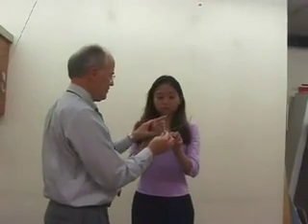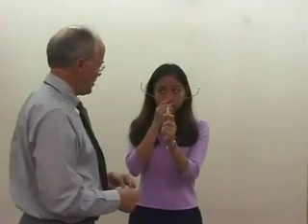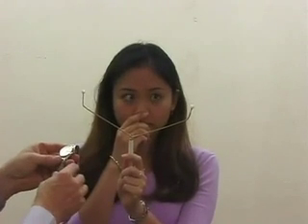All right, let's go ahead and do the testing with the Saccadic tester now. Okay. I'll say ready, begin, and then we'll go for 10 seconds. Okay. I'll tell you when to stop. Start here. Ready, begin.